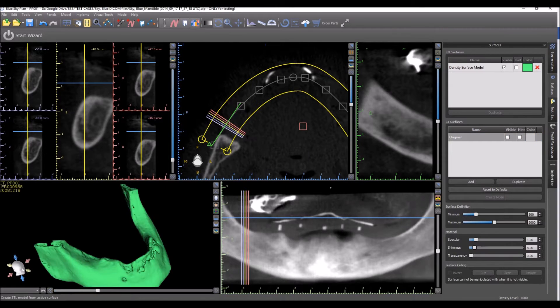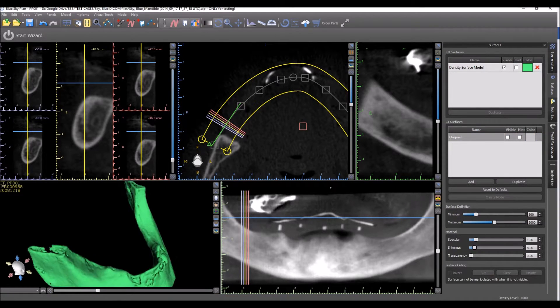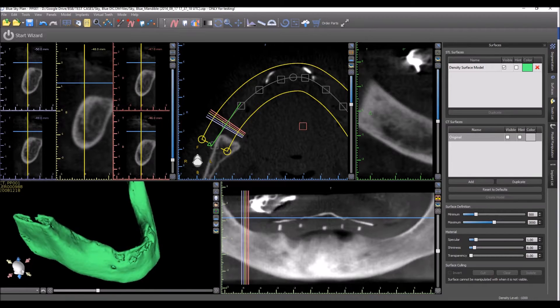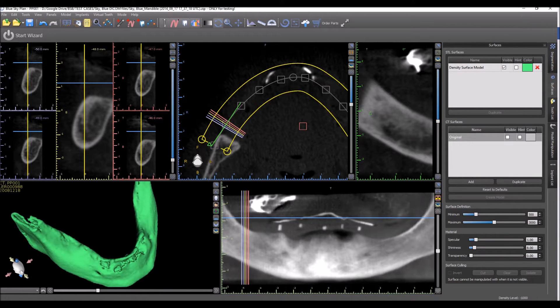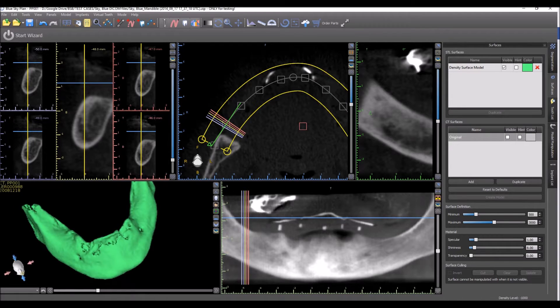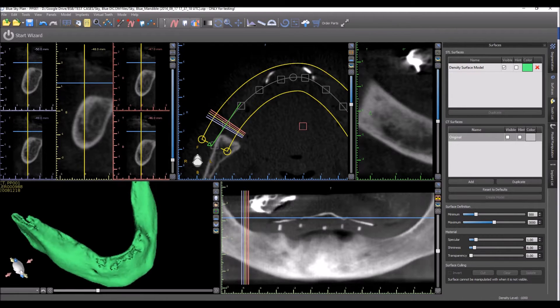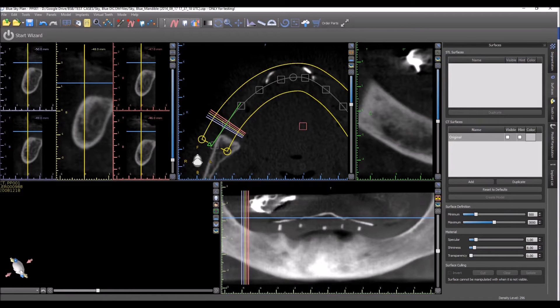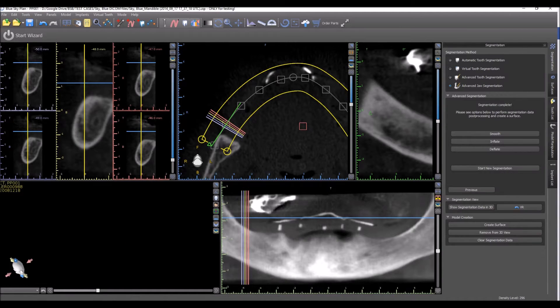The software will then create an STL file. The problem in a case like this is that if we tried to create a surgical guide based on this, or if we tried to reduce it, we'd run into problems because of all the holes and issues with the bone.